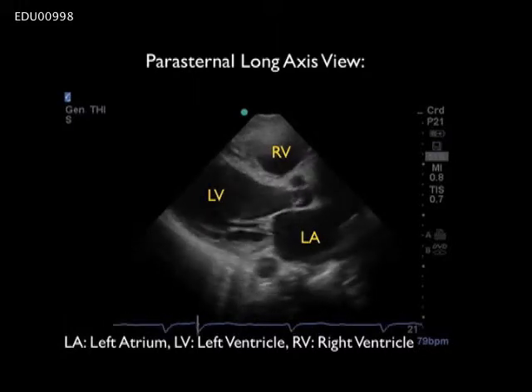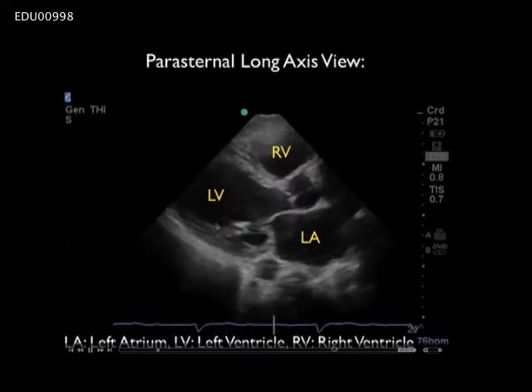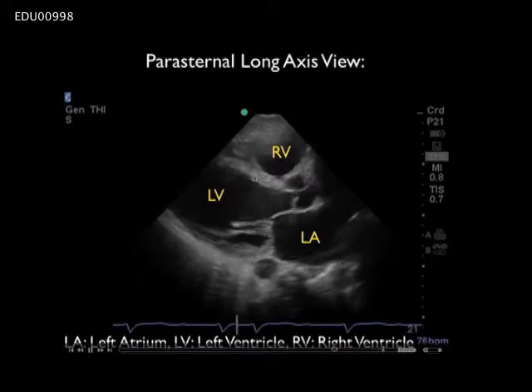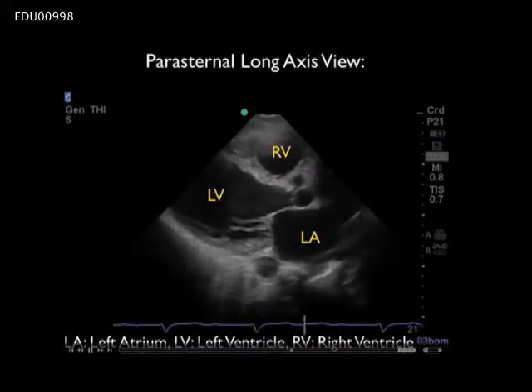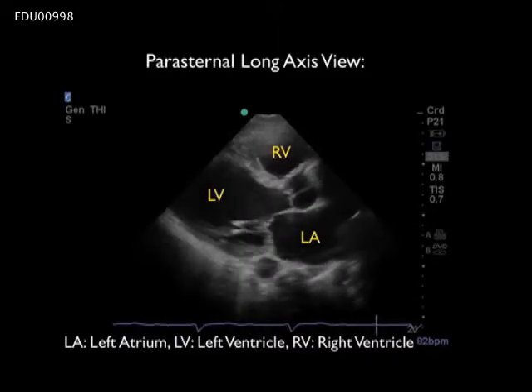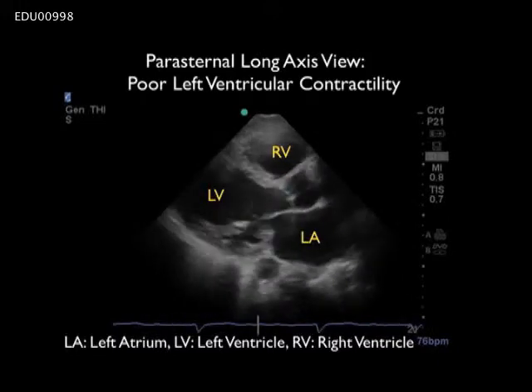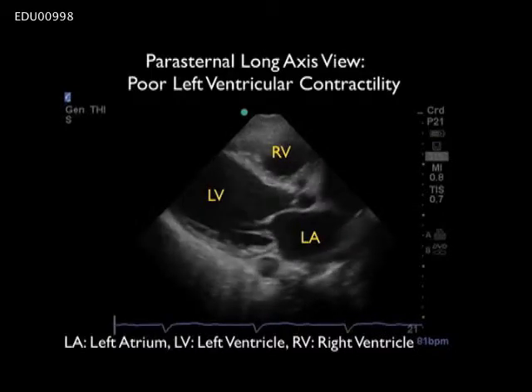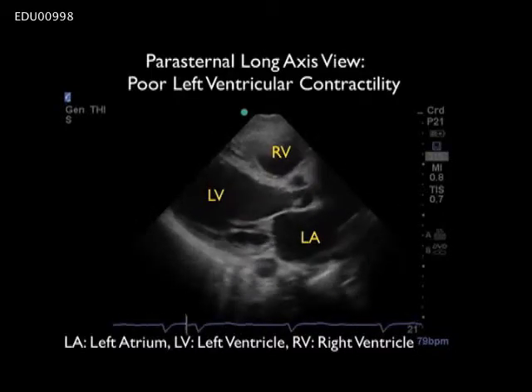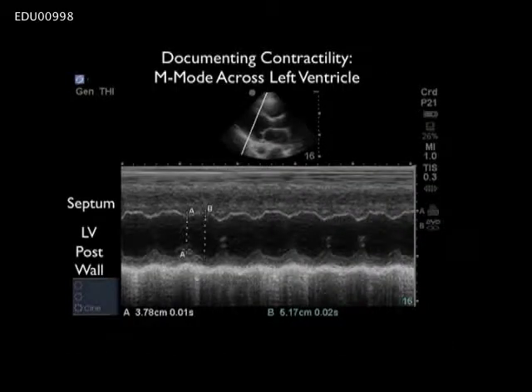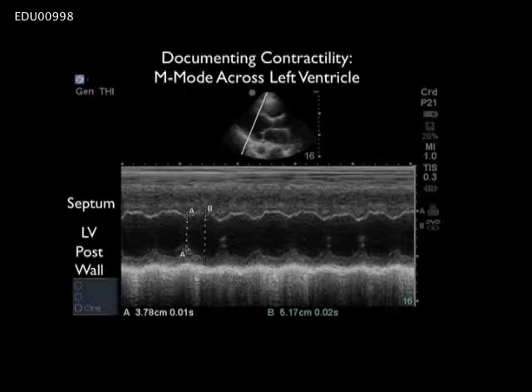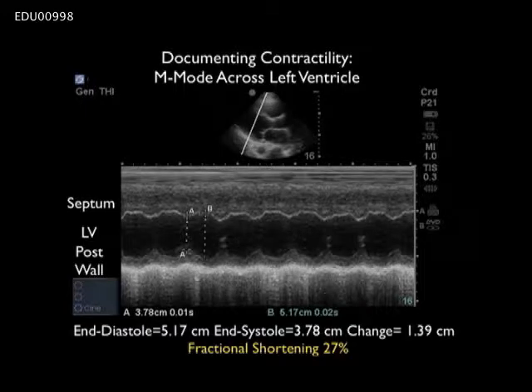Now let's look at another patient who came into the emergency department with a low blood pressure of 80 over palp. From the parasternal long axis view we see very poor contractility of the left ventricle — the endocardial walls move little from diastole through to systole, and there's little motion of the mitral valve, indicating poor blood flow between the left atrium and left ventricle. In this patient we're going to have to be careful about fluid loading as this patient may easily go into pulmonary edema. Fractional shortening is calculated at 27%, confirming very poor contractility with end systolic diameter of 3.78 and end diastolic diameter of 5.17 centimeters.